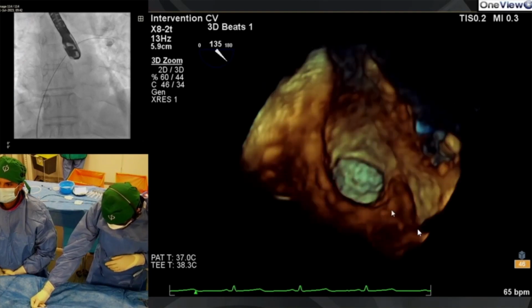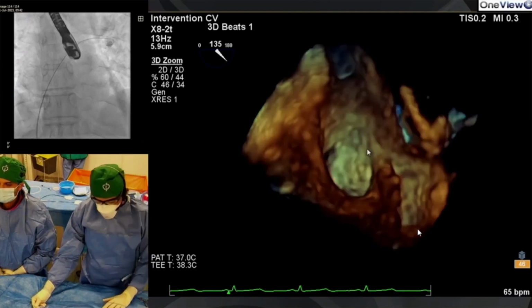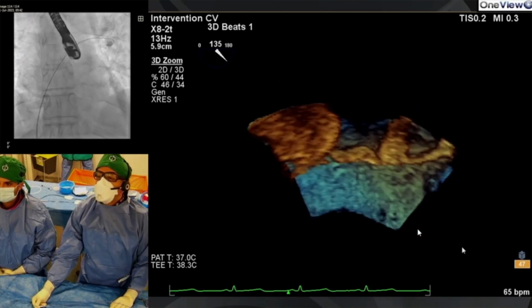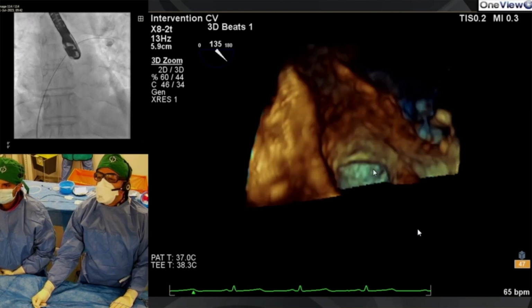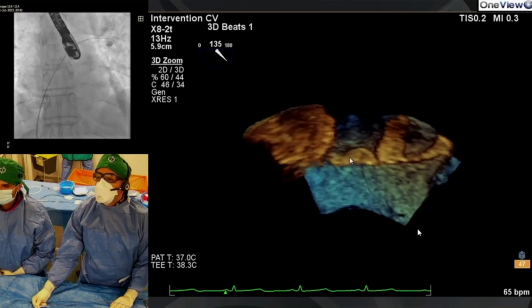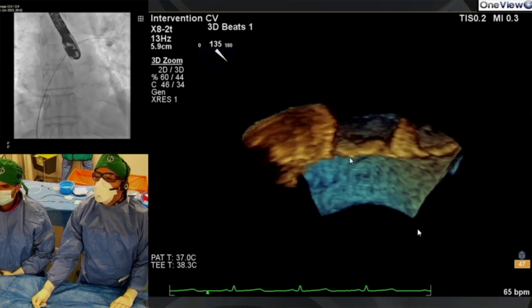And if I look up from the bottom on the IVC into the PFO, this is what it looks like. So I've just cut into that same picture. So there, just to get your landmarks, there's that picture again. There's the top of the fossa. There's that lip of tissue. If we roll it down and have a look, can you see how much that PFO is opening? Oh, let me stop it at the right moment.